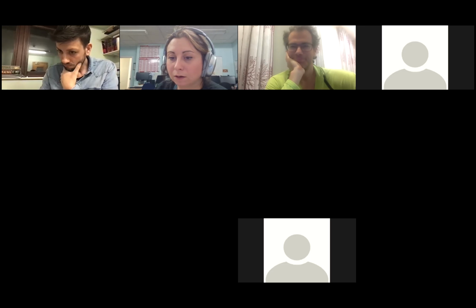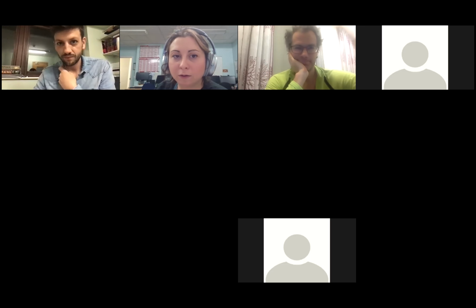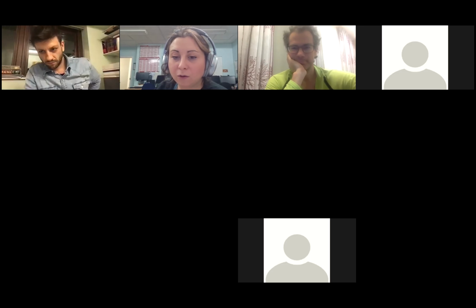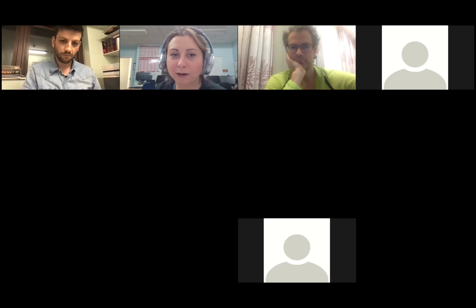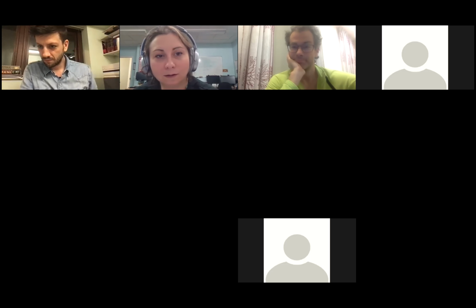Okay. Enlightening. Right, so I'd say give it a go. I don't think lung ultrasound is particularly difficult, and lots of people in your apartment, I'm sure, have had a go at it recently. So I'd just give it a go. Just be very careful with cohorting people on the wards saying they have COVID if you're only going on the ultrasound, so the medical director gets very angry.